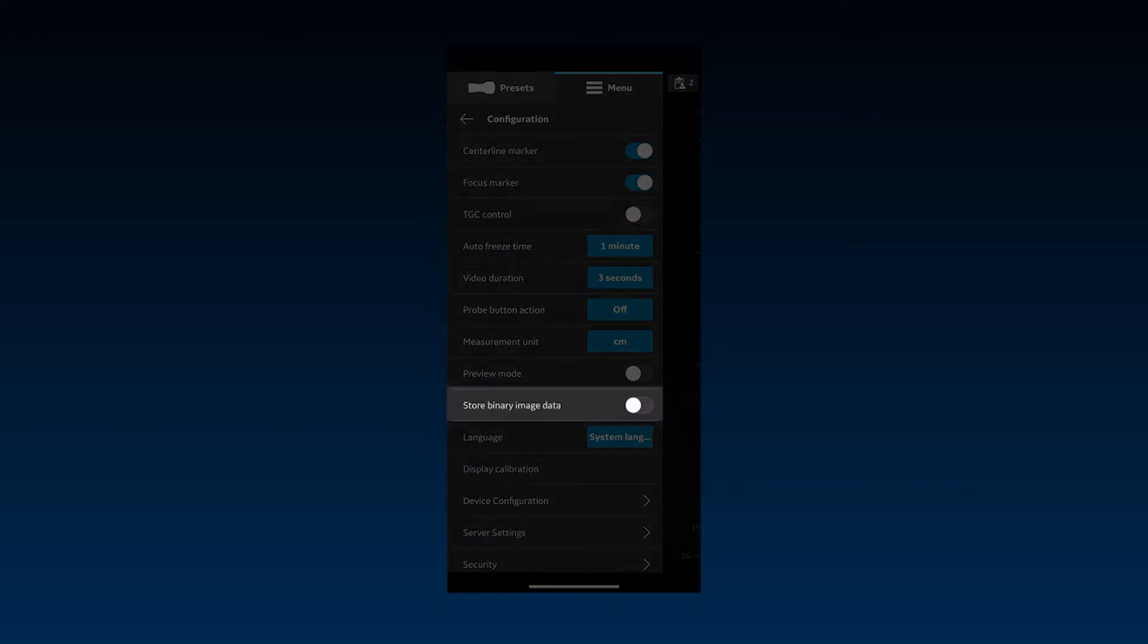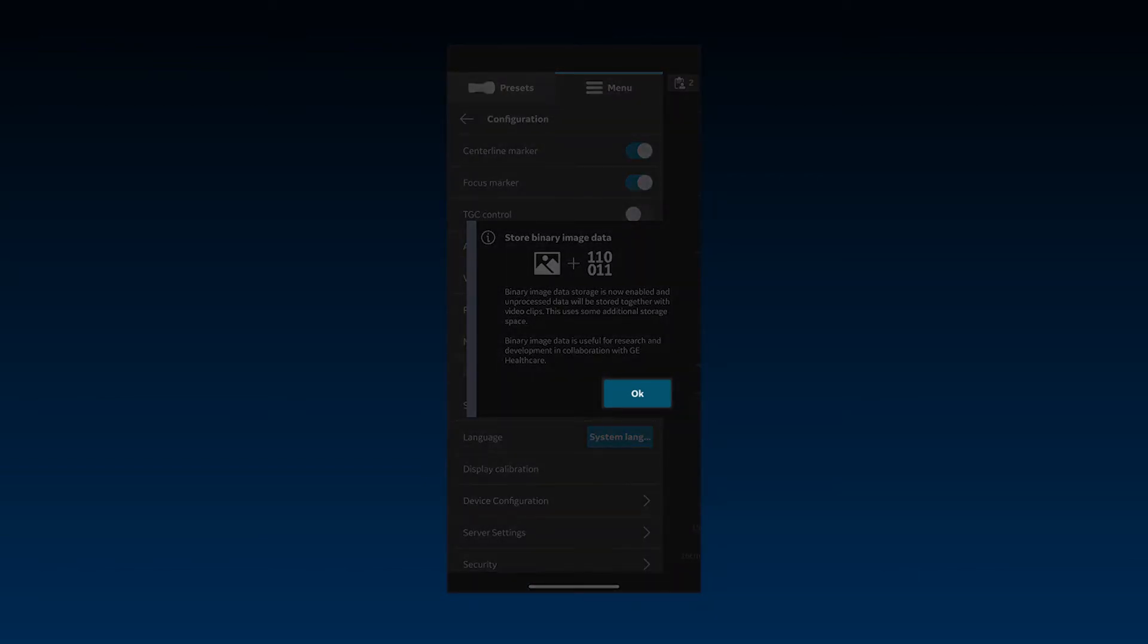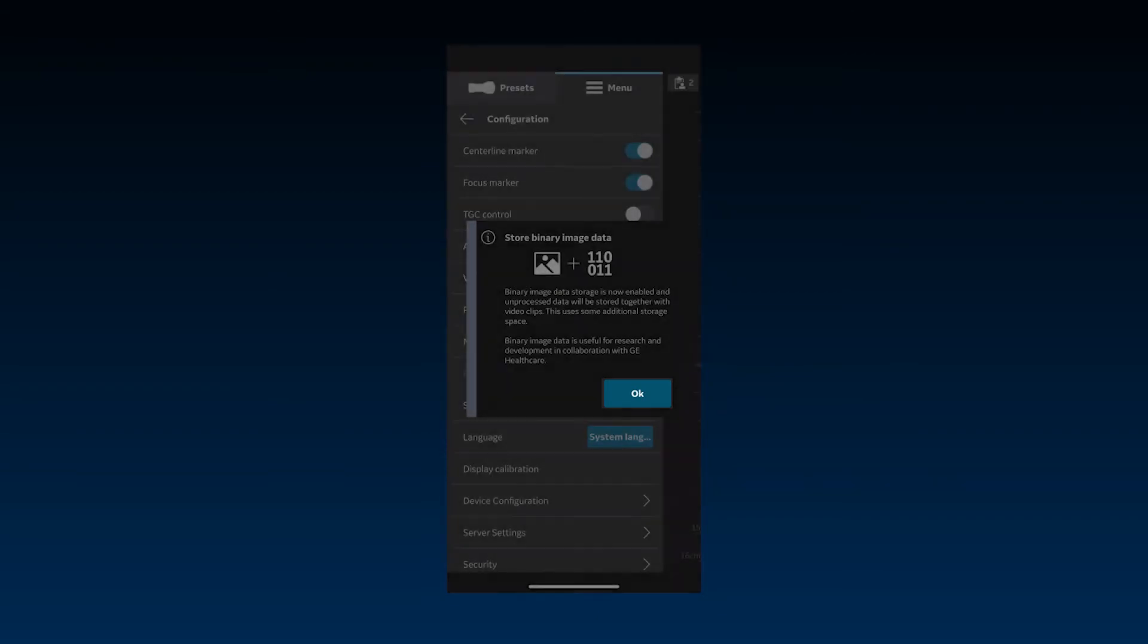Store binary image data provides an option to save images with additional unprocessed data capabilities. This requires some additional storage space. This binary image data could be of interest when collaborating with GE for more sophisticated image data management opportunities. Acknowledge the on-screen message to confirm enabling this option.